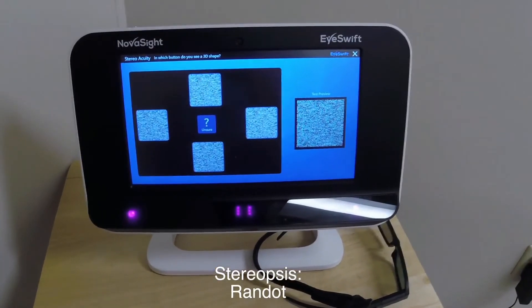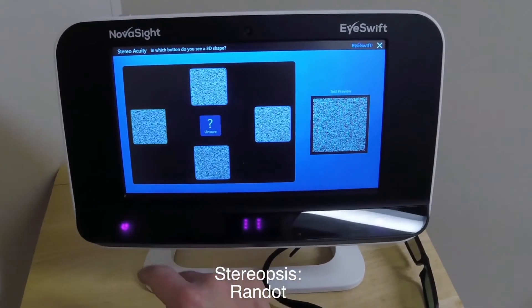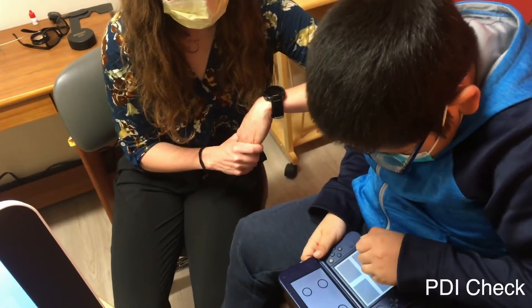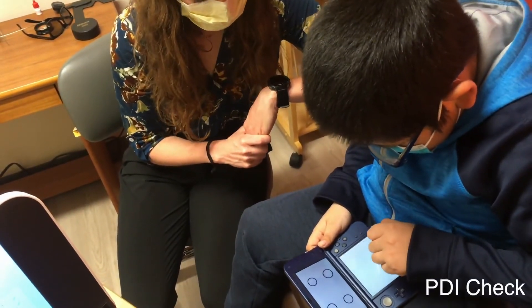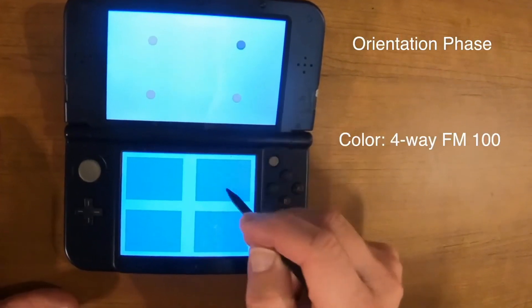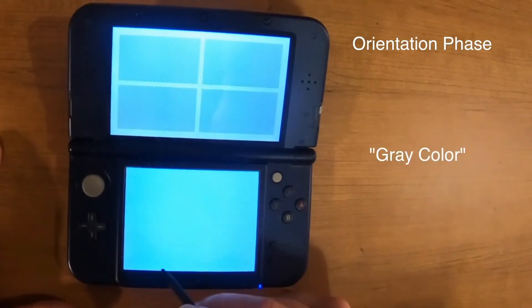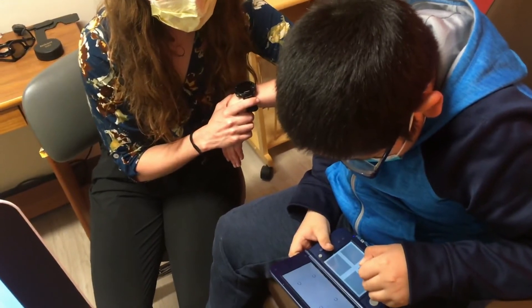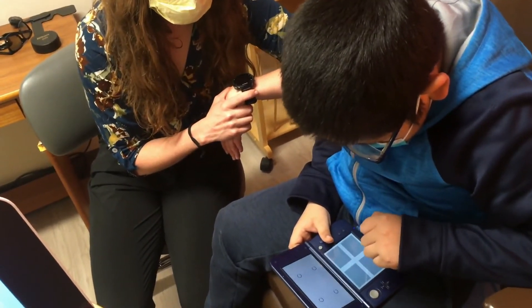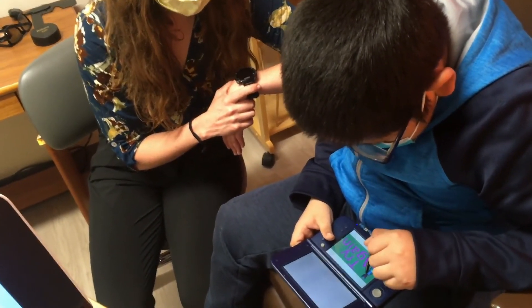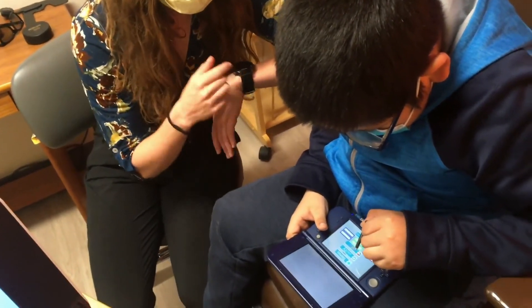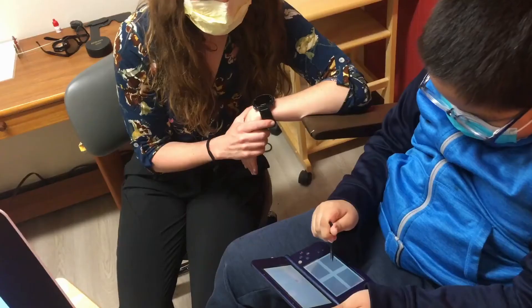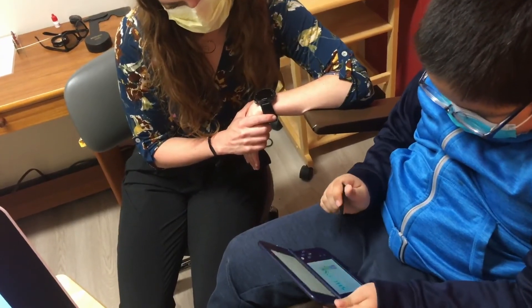This is stereo. We're looking for the one with a box. Nice job. Okay, so let's pick the different color. This is on its side — press that square. Oh good, you almost did it. Try it again, let's try that one more time. Nice job.